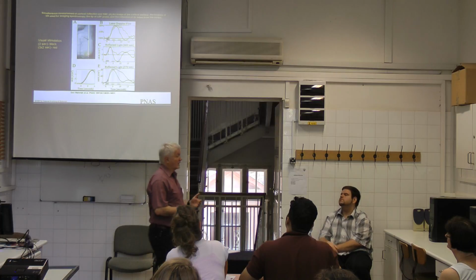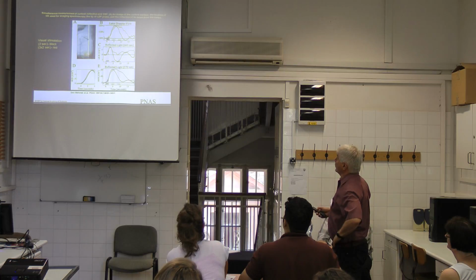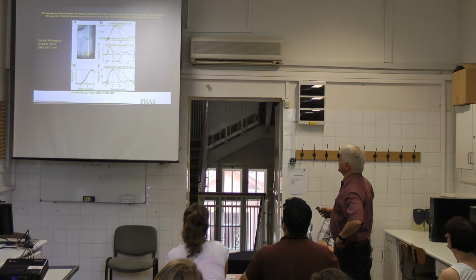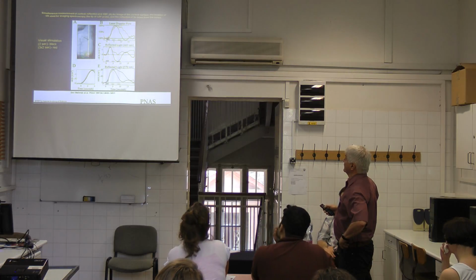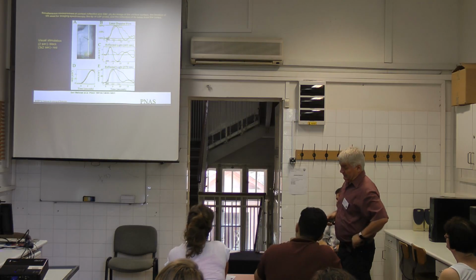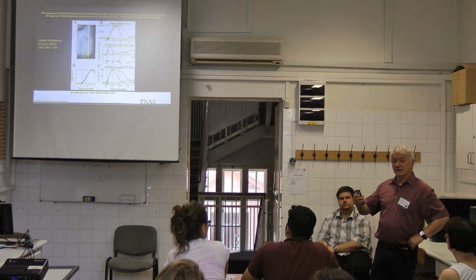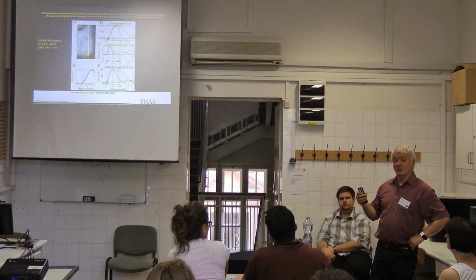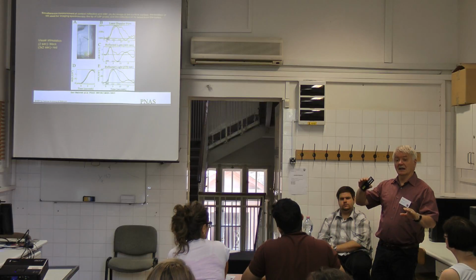And now we are coming closer and closer to more and more sophisticated methods where we combine the laser method. This is the laser Doppler flow. This is the reflected light. This is in various wavelengths, because the hemoglobin absorption is depending on wavelength, and the dependence of the hemoglobin absorption is showing how much oxygen and how much carbon dioxide is in the hemoglobin.